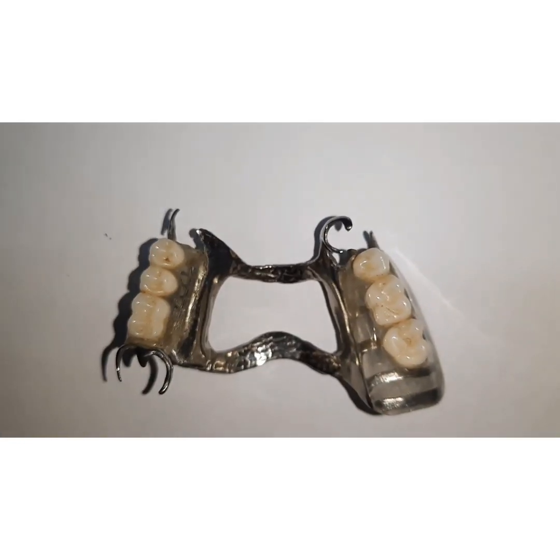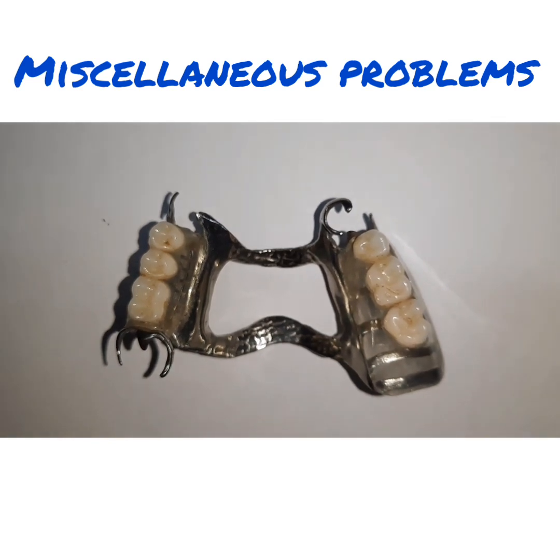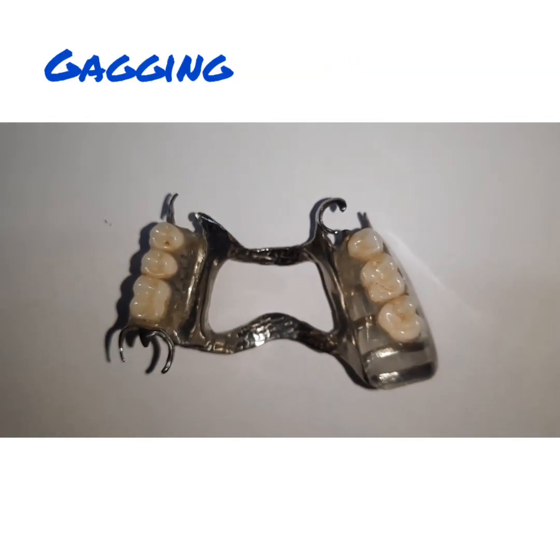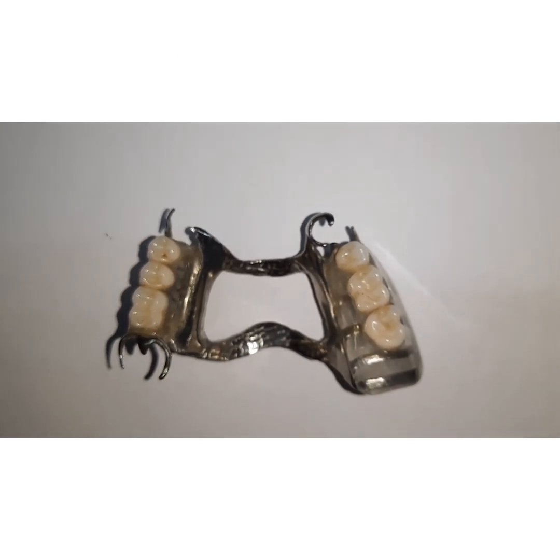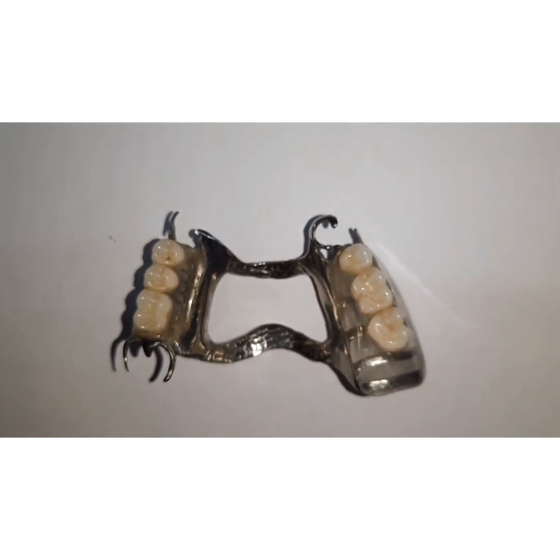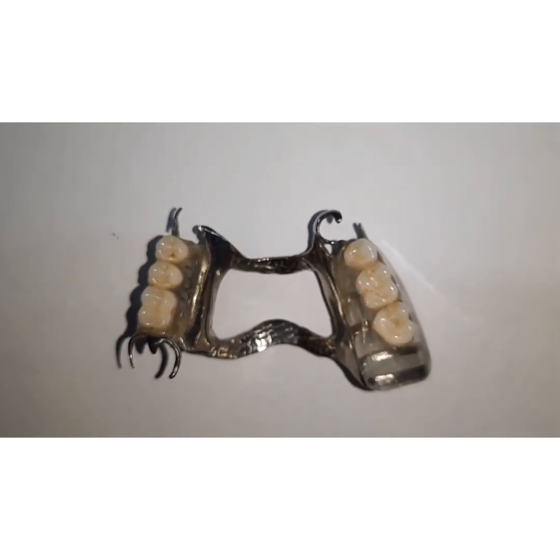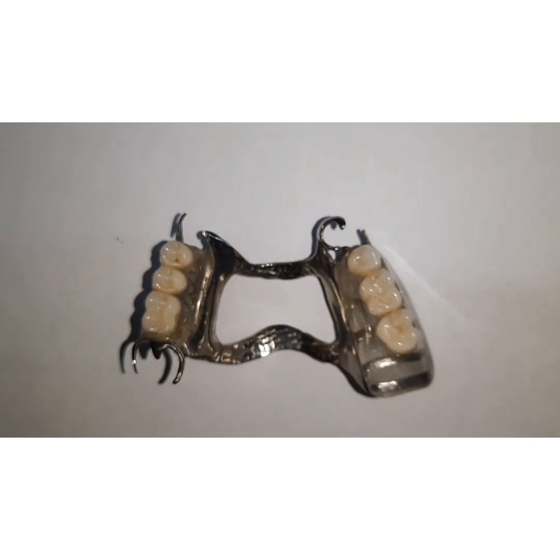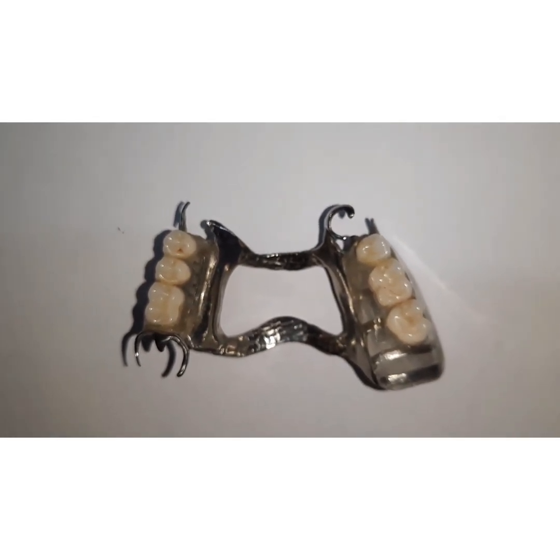Apart from this, there could be troubleshooting because of miscellaneous problems. The patient may complain of gagging. Now, this could be because of the overextended maxillary denture in the upper arch, where the patient has not become comfortable with that. So that overextension is removed using an appropriate abrasive. Another thing, there could be a problem because of the cheek biting.